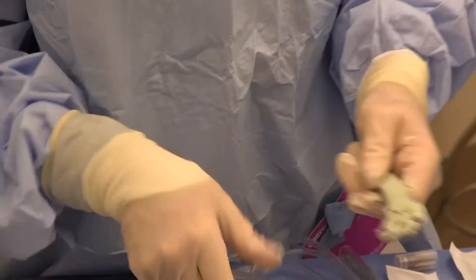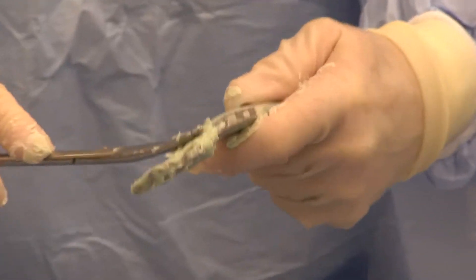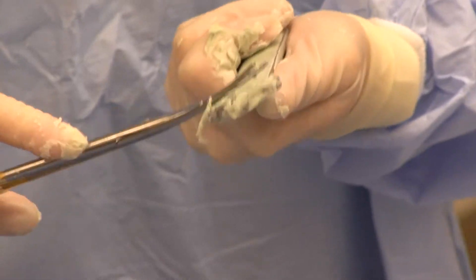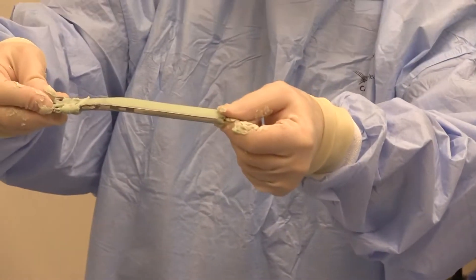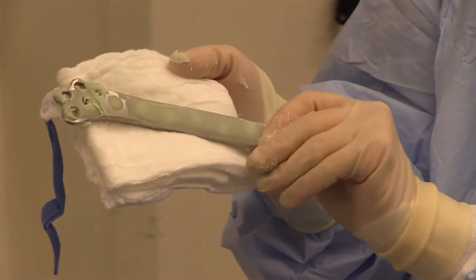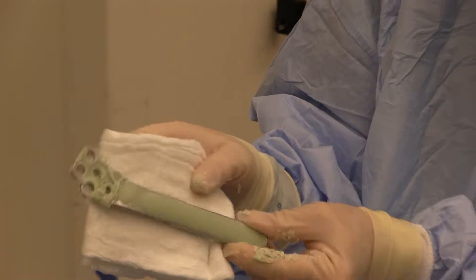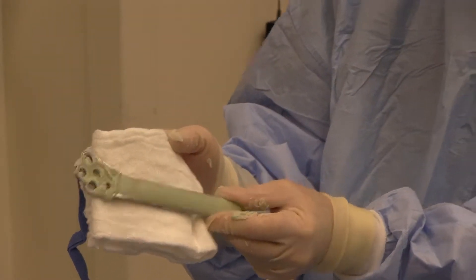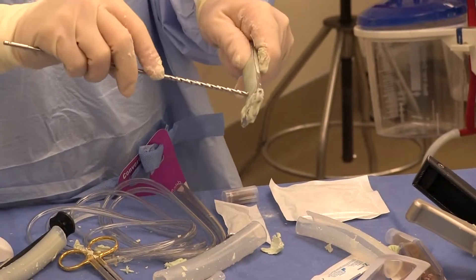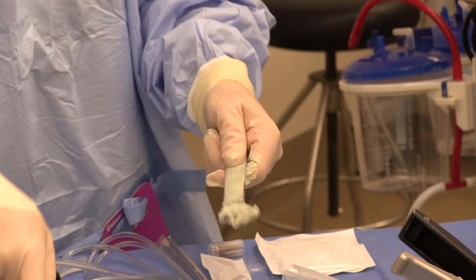As you can see, this doesn't take too long. And if you're worried about the plate sitting, you can trim some of this or even use a burr. But if you just look at the thickness of the plate, it really doesn't add very much at all — it's not too bulky. You have the whole plate coated with antibiotics. You can patch it up if you need to, but it comes in handy. The whole plate portion that is next to the bone is completely coated. Because this cement has now gotten hard, I'll need to use a power drill bit to drill the rest of these out, but I was able to do a lot of these screw holes before it got too hard.